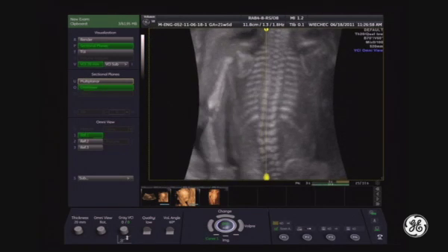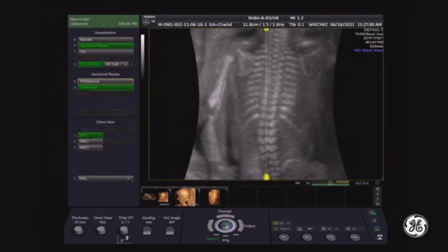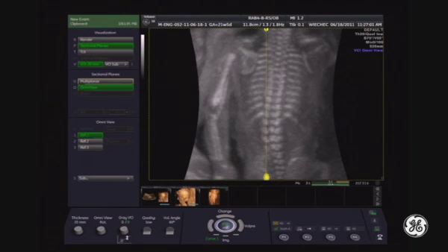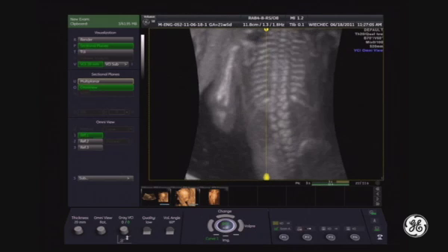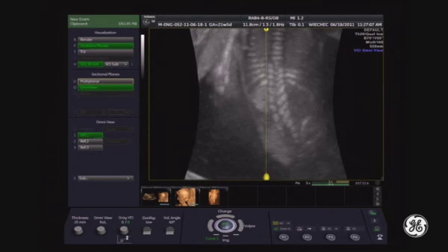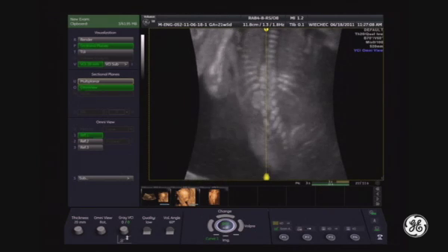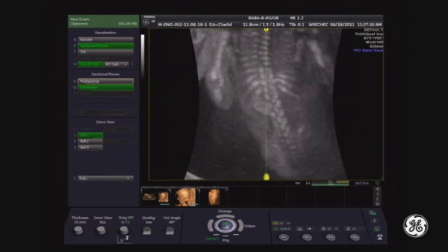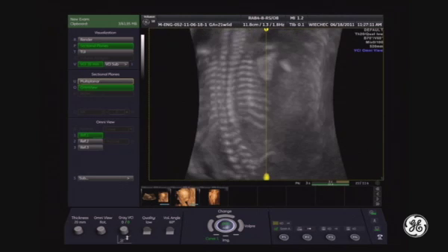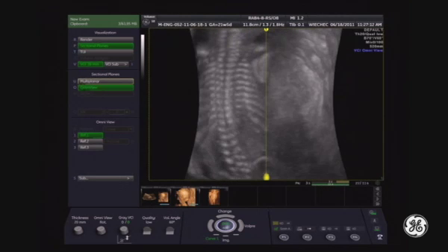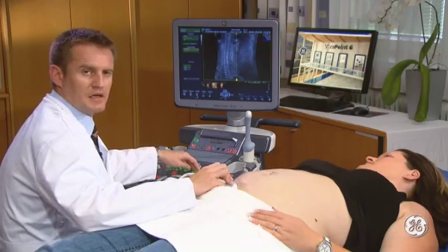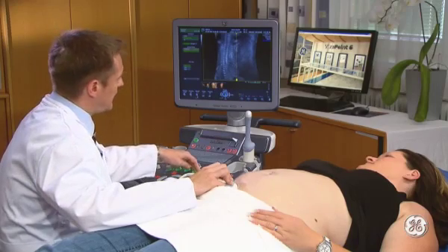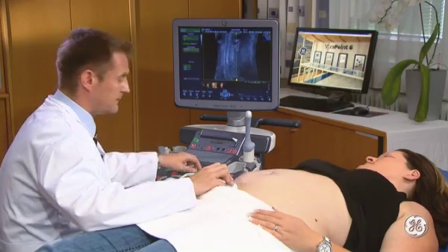This is different — it has the advantage that you can see the spine in motion. You can move the transducer to the lowest part of the spine or to the highest parts. This is the difference between static and dynamic acquisition for the fetal spine.